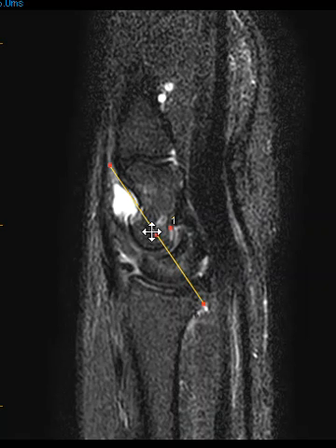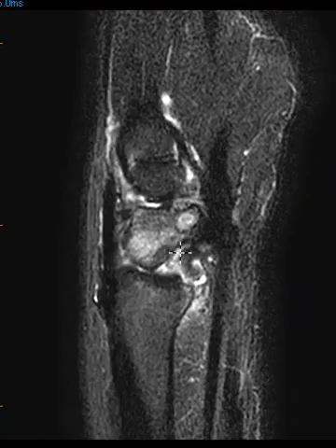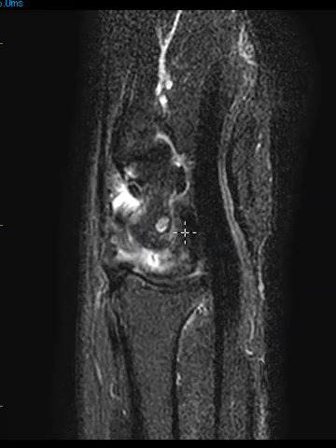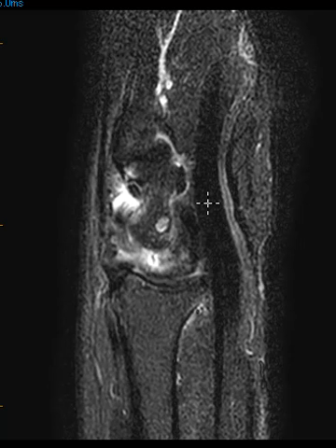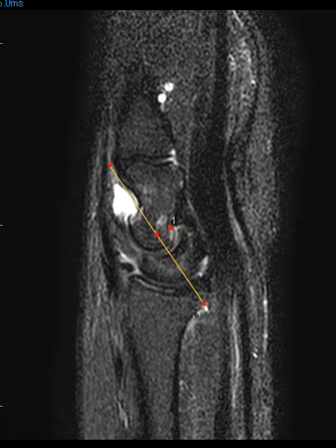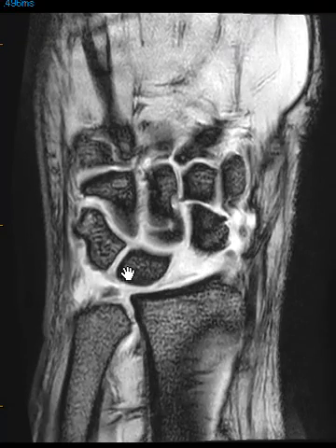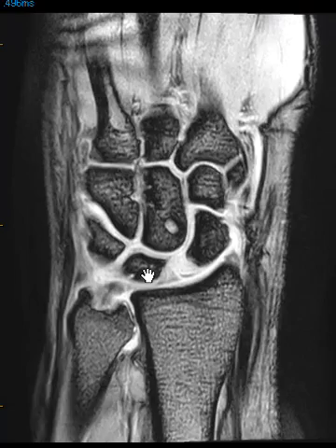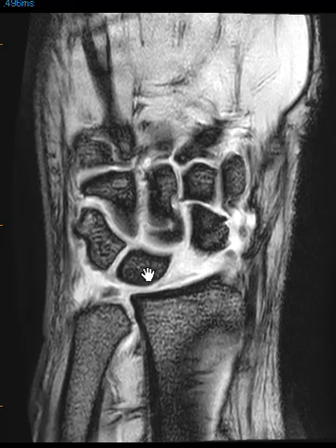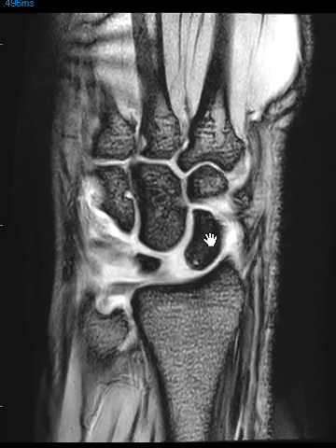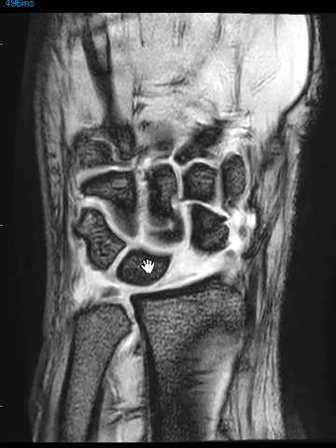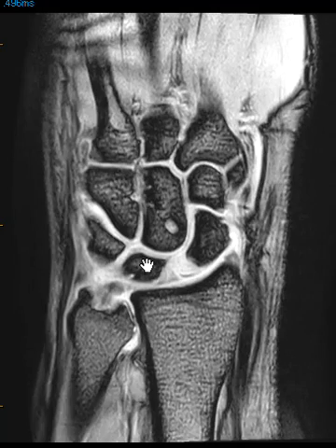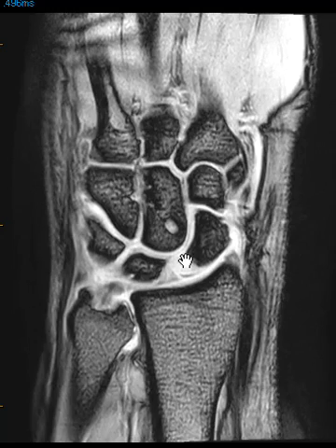The combination of these findings — a proximally migrated capitate bone with widening of the scapholunate interspace, dorsal tilt of the lunate bone, and these abnormal angles — all go with the diagnosis of dorsal intercalated segmental instability, which is DISI. Over time, there's abnormal pressure on these bones, especially the lunate bone, and you can get what we call a SLAC wrist — scapholunate advanced collapse — with remodeling and degenerative changes that are severe within the scaphoid and lunate bones.